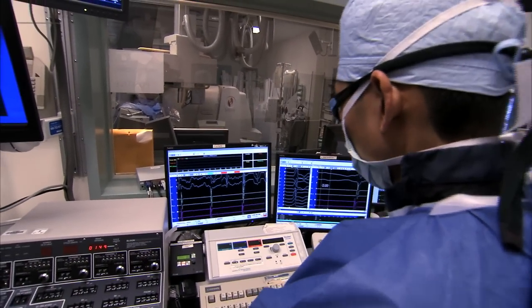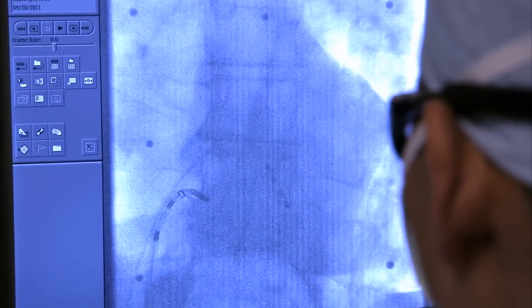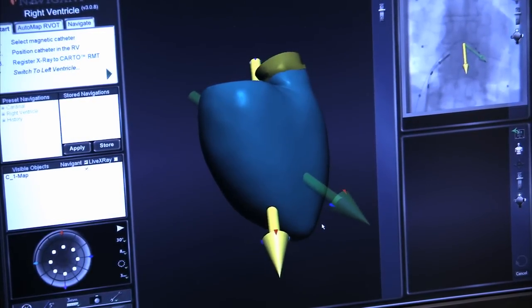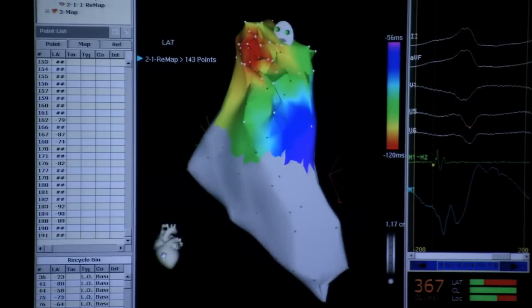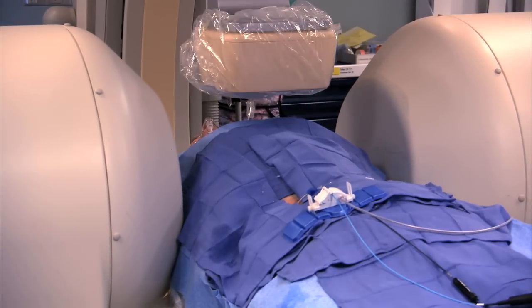So in summary, catheter ablation for the treatment of ventricular tachycardia is a procedure that really relies on us being able to precisely localize where the site of tachycardia is actually coming from. It is through real advances in technology that we've been able to now perform this procedure not only effectively, but safely, such as the use of 3D imaging, where we're able to visualize where that spot is actually coming from, or the use of magnetic remote navigation, where we're able to move catheters safely as well as precisely within the ventricle. Catheter ablation is an emerging tool in the treatment of ventricular tachycardia, and alongside other therapies such as medications or implantable cardioverter defibrillators, it should be a treatment that is considered anytime you're dealing with ventricular tachycardia.